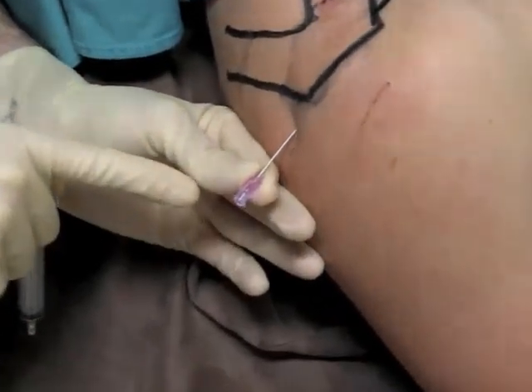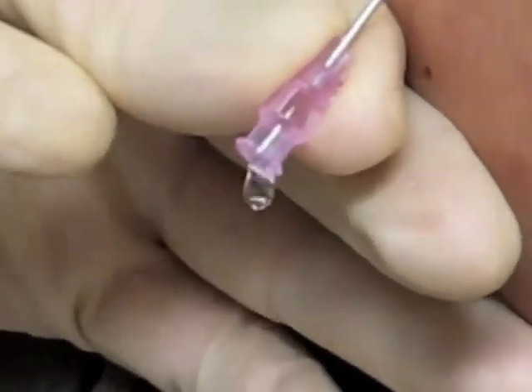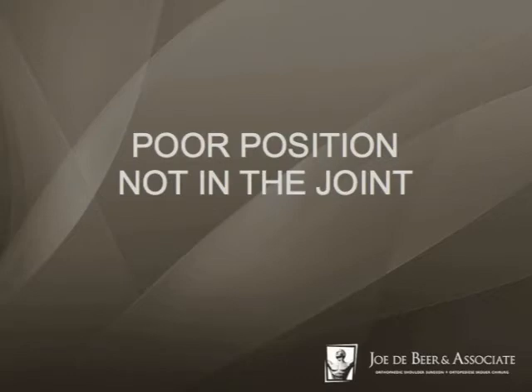And in this case, you can see how drops are coming out of the needle, proving that there is intra-articular placement.